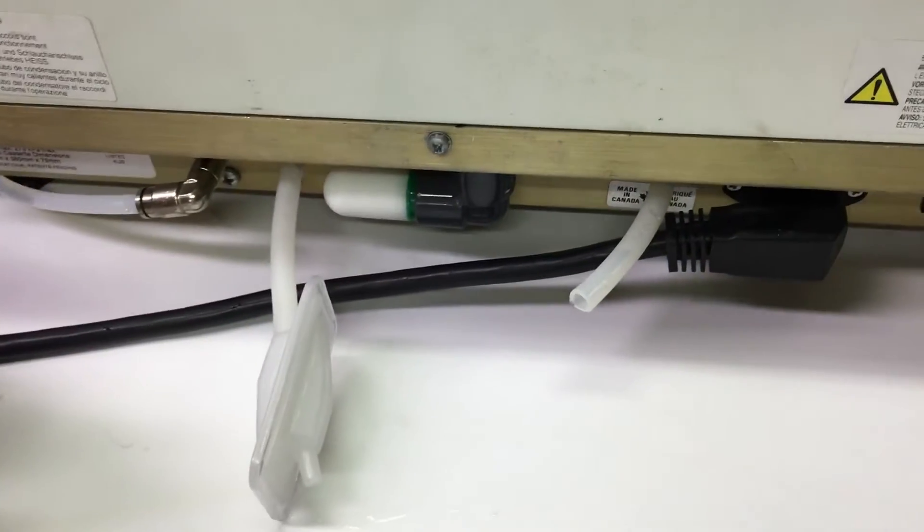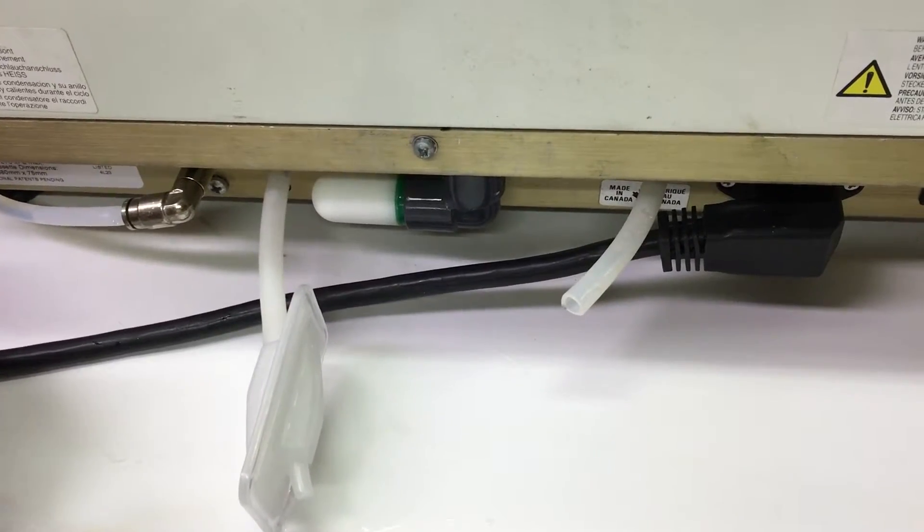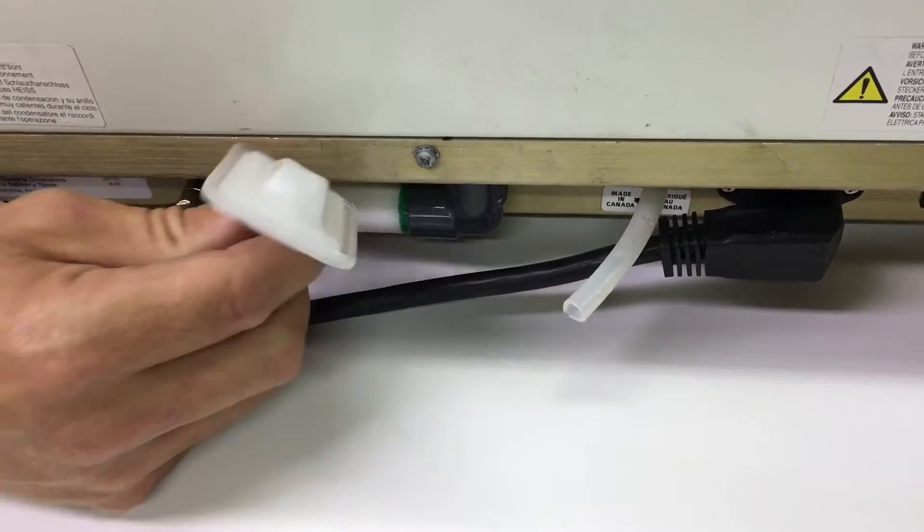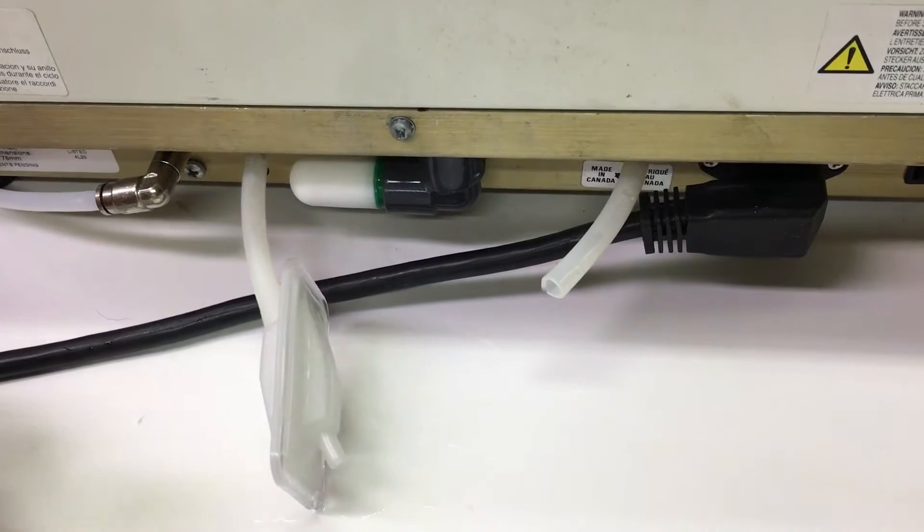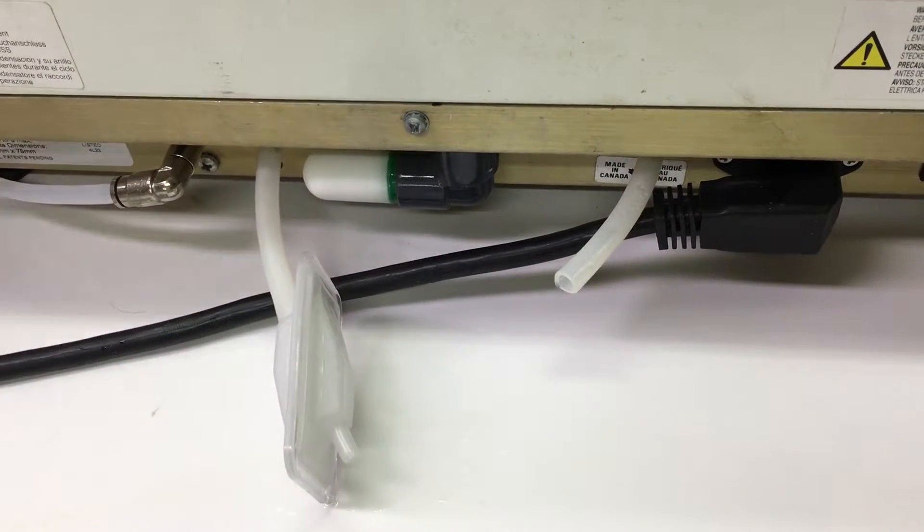So if you're experiencing that your machine is not air drying, then this could have been what happened. I recommend giving us a call. We can help you with this problem.